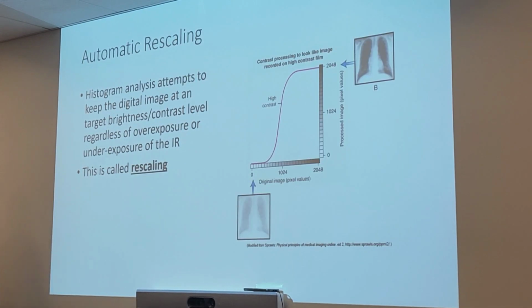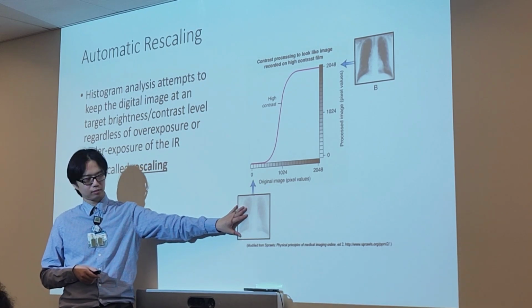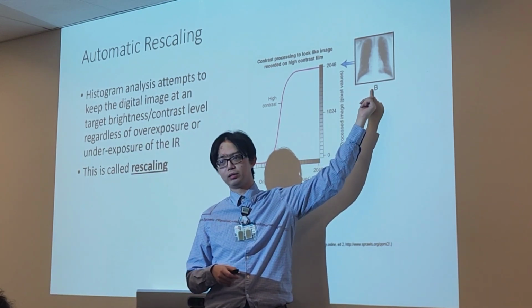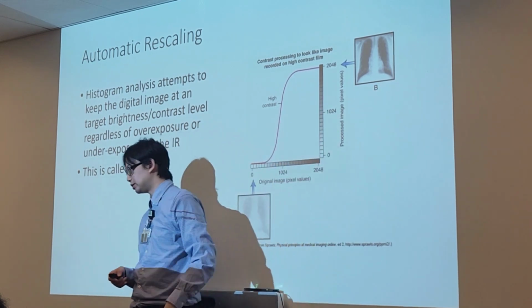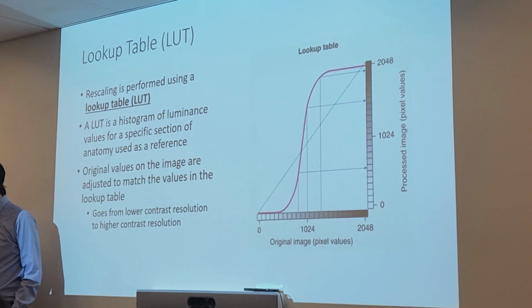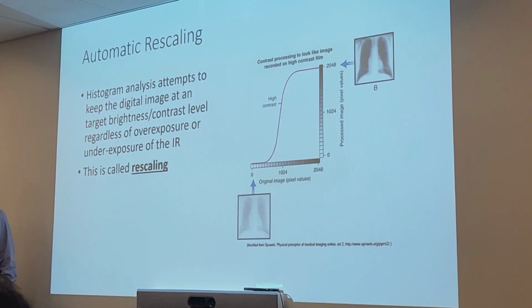Mr. Phung, quick question. Okay, so you said the before image, like before it pops up, that's what is being collected, is the raw data, and we take this and do what with it? And then we will end up converting it into the final image. Okay. So this is your true manifest image, right? This is the image that we're actually going to see. Thank you. So it's like a preview of the manifest. So in between these two images, you're doing the post-processing, sir? No, this is pre-processing, right? You're not doing anything to it. The computer does it automatically.